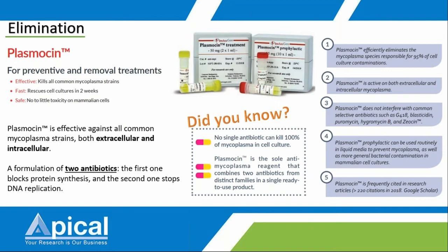All right, it is effective against all common mycoplasma strains, both extracellular and intracellular. This Plasmocin consists of two types of antibiotics. The first one blocks protein synthesis, and the second one stops DNA replication.